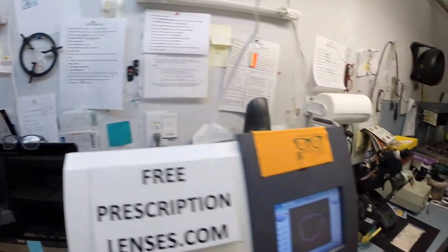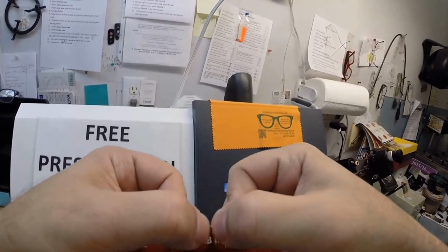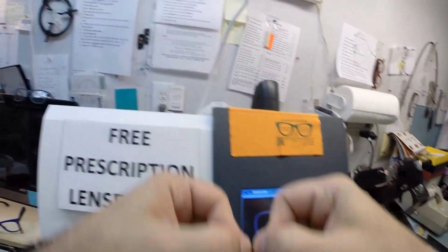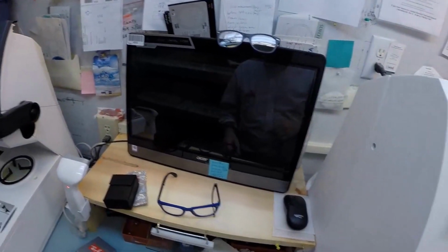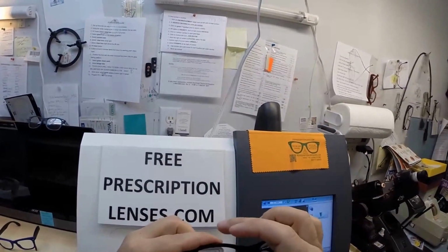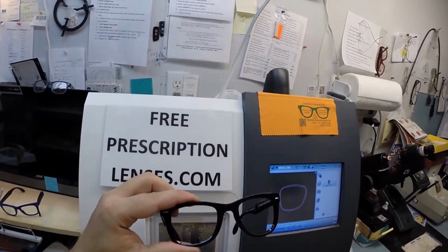Now, a millimeter, to all my American friends who have no clue, a millimeter is the distance between my thumbnails. I'm going to take 1/5 of that distance off, going all the way around until it fits in easily. I don't want to force the lens into the frame. It would cause the frame to stretch or to roll, as we in the business say.